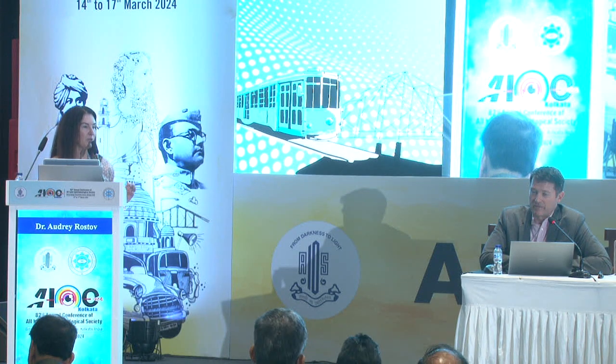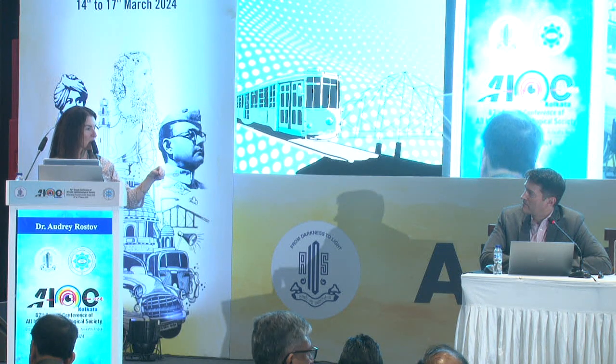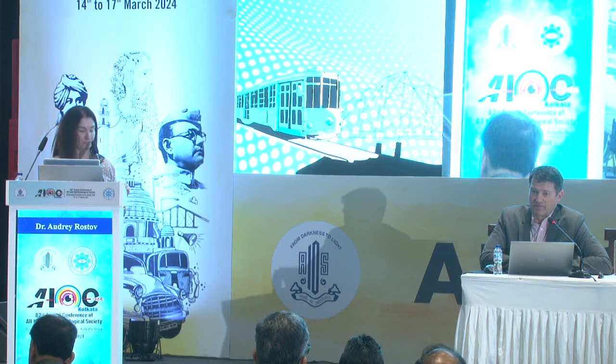It will come off. So you need to avoid it, as Jode said, both during the YAG as well as be careful of it. Don't touch your instruments to it during implantation or during your IA. Okay, good tips.